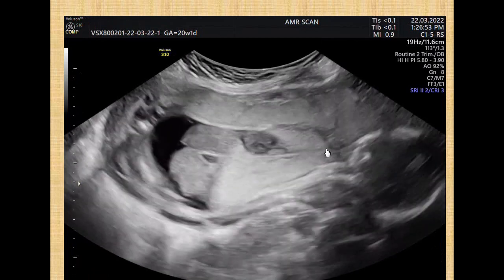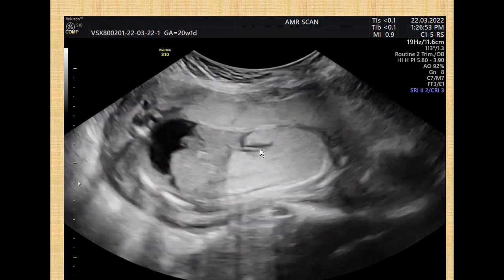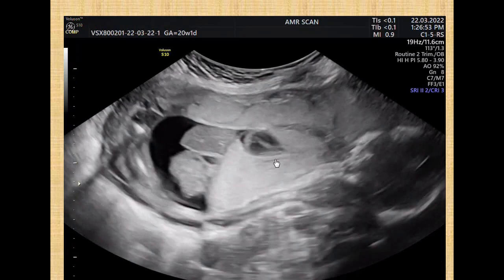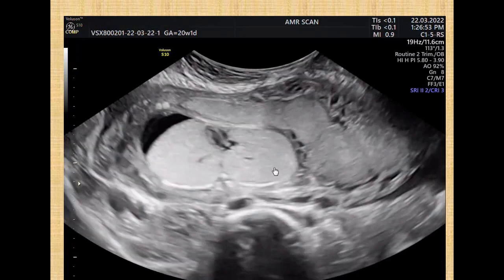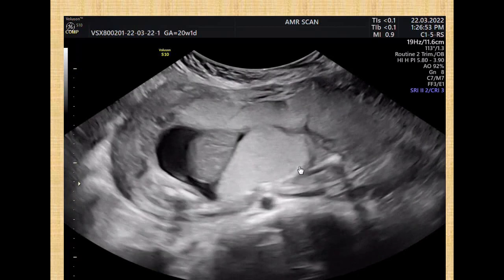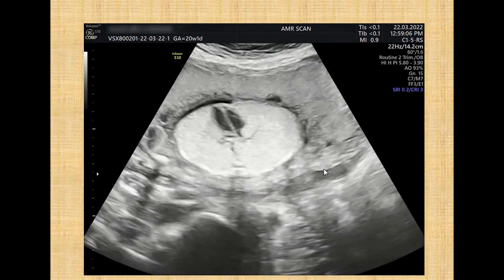Again, another video. And here you'll notice also, beside the inverted diaphragm, that there is a fluid-filled trachea behind the superior vena cava. Right here. Here again the inverted diaphragm and the abdominal ascites and the hyperechogenic lung, and you will notice the fluid-filled trachea and the fluid-filled bronchi beyond the heart.